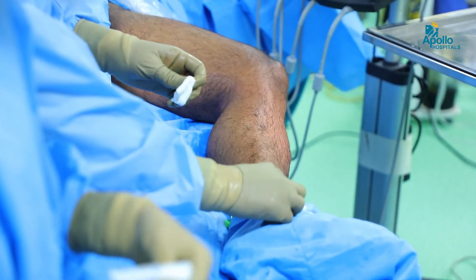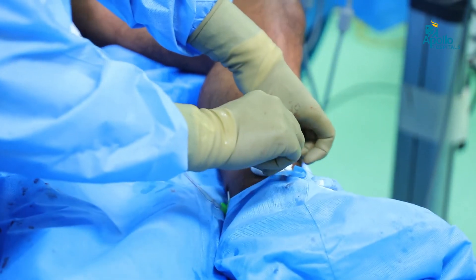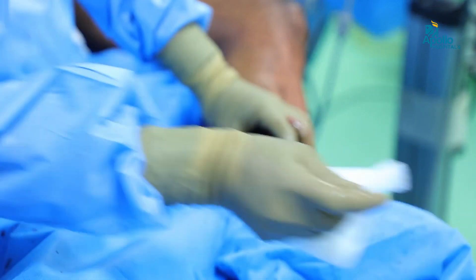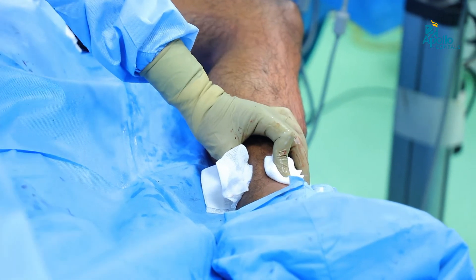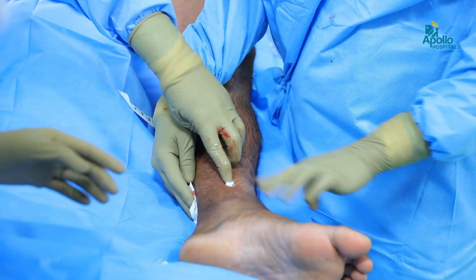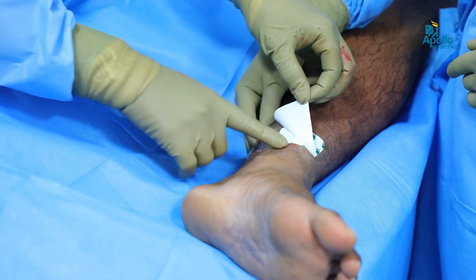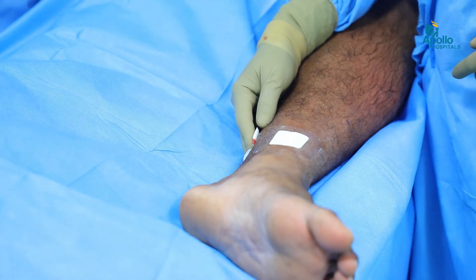Now the procedure is done. We have given sclerotherapy for all the perforators and we just remove the sheath and the procedure is complete. We apply compression stockings along with crepe bandage for 24 hours. After removing the sheath, a waterproof dressing has been applied so that it will be comfortable for the patient to take a bath.